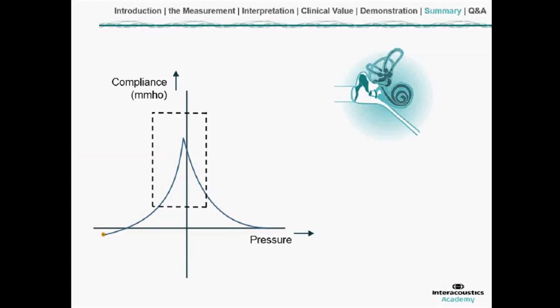Now, with regards to the different diseases or pathologies that can take place in the middle ear, I think that tympanometry has proven to be a really valuable tool over the years. And I think its success is partly because of the ease in which you can do the measurement, and the ease in which a tympanogram is understood. At the same time, I hope that people can be critical enough to see that just doing tympanometry in this way, it doesn't allow you to differentiate very well between one or the other pathology. You're always dependent on other measures. Very often you have to do additional tympanometry measures like reflexes or eustachian tube function tests, or you have to look at the audiogram or even CT scans or MRI scans.